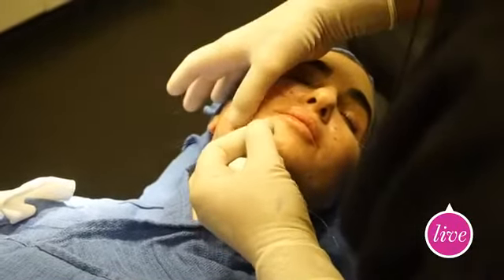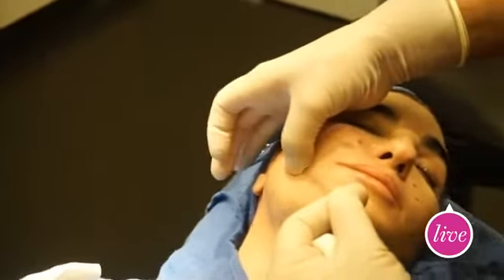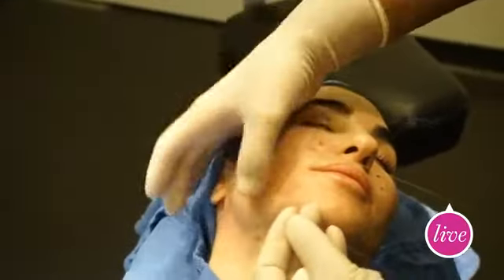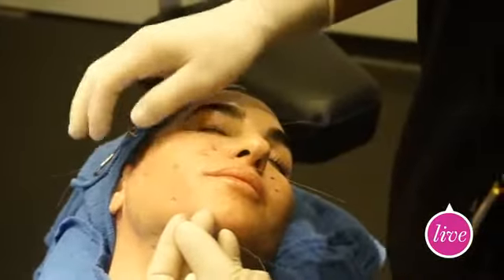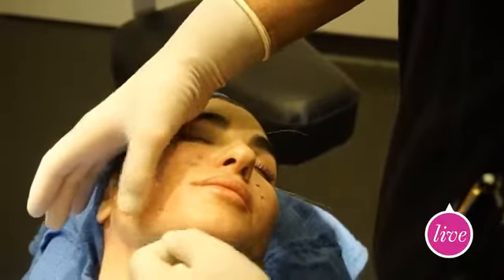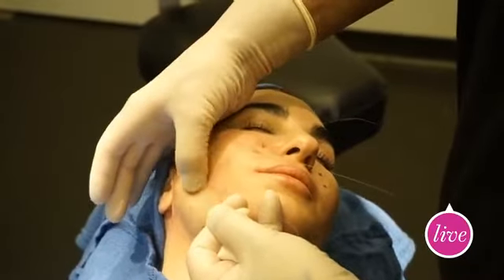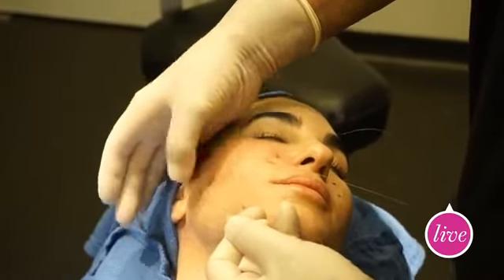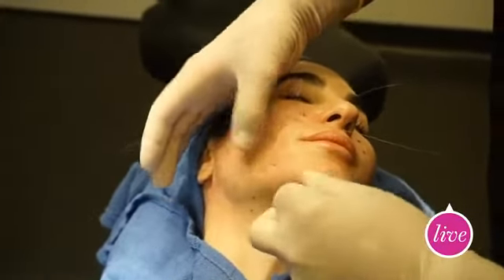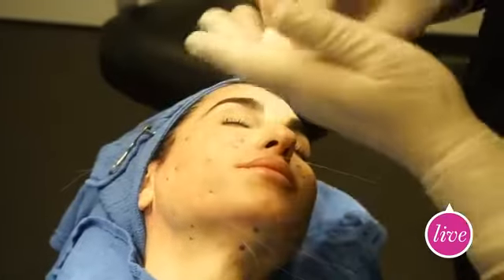So what I'm doing right now is in the jowls, just advancing, and you can see I'm advancing to the point of insertion, and I think it's just the coolest, just eliminating the jowl. And you can see that there is redundancy of the skin. This takes about 2 days for everything to smooth out. Wow. It's crazy that results are so instant. Yeah. I think the design of this particular device is simply brilliant. It's simple and brilliant, which of course I love.